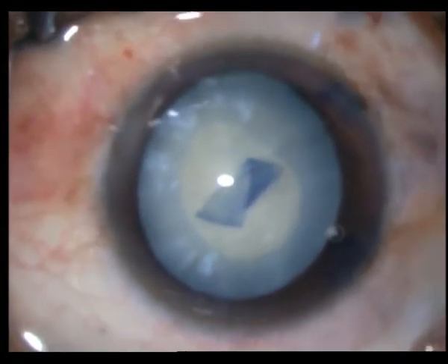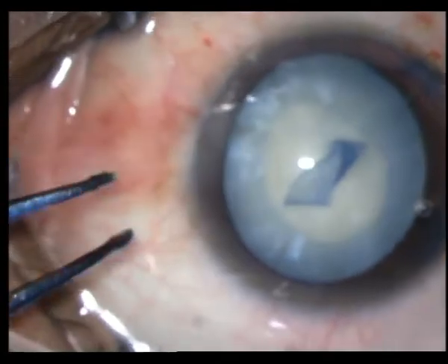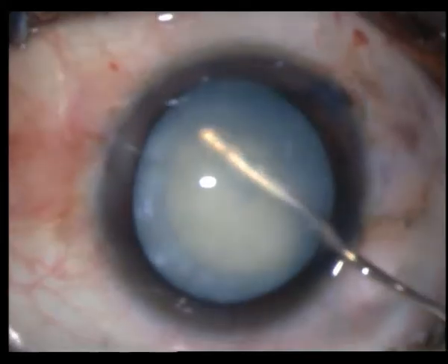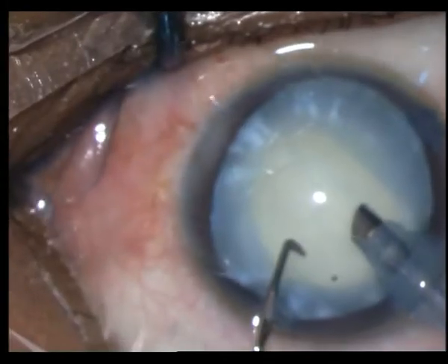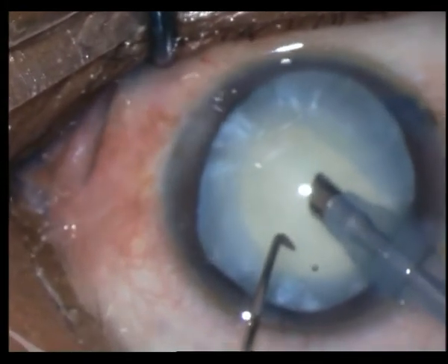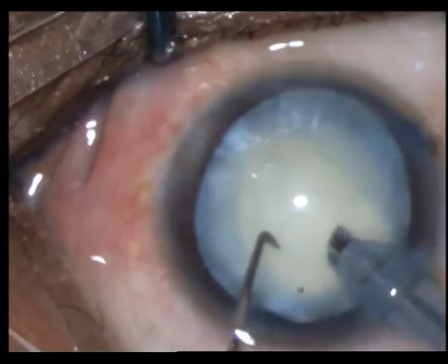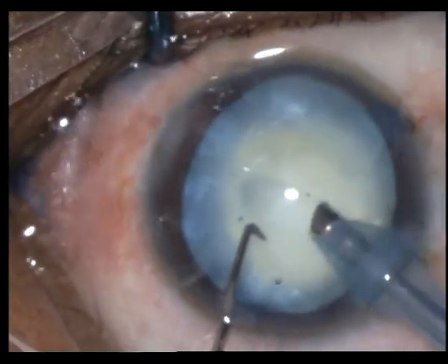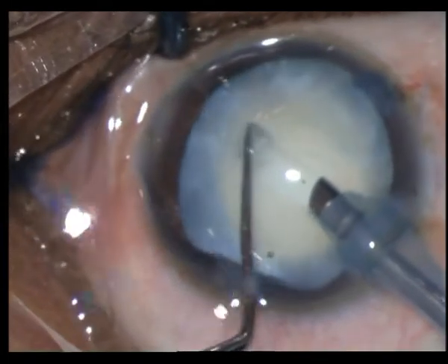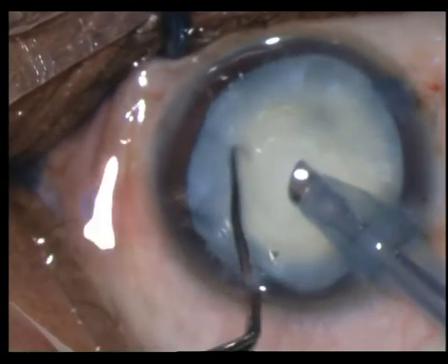The other axis of the rhexis is complete. I just check the rotation — no need to do hydrodissection in most of these cases. Now I go in with my sharp chopper and my phaco probe. The cataract is very soft, just eating away — not even able to get a hold on it.